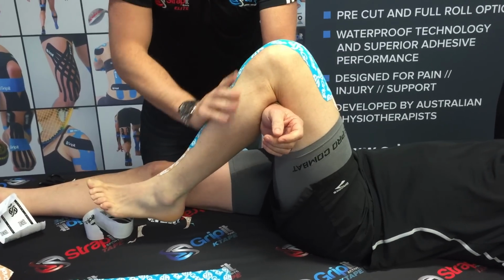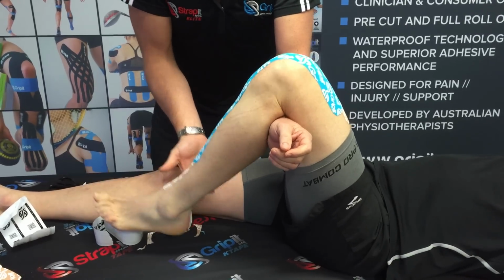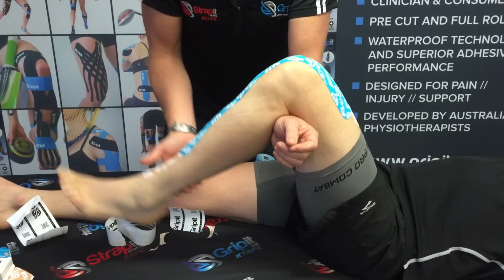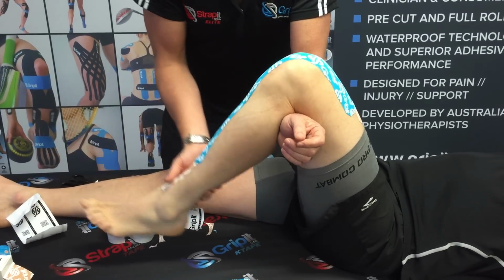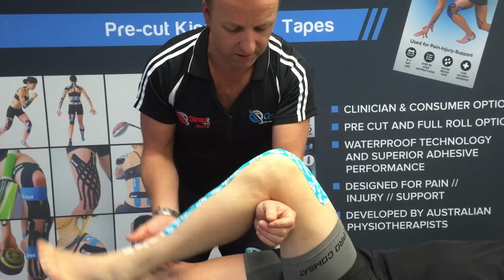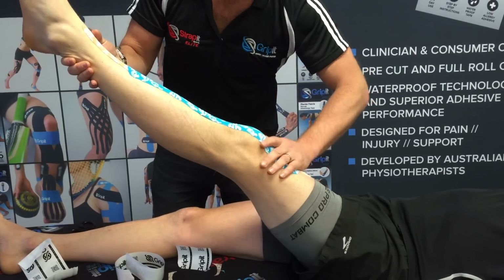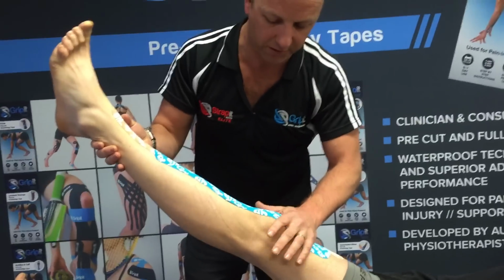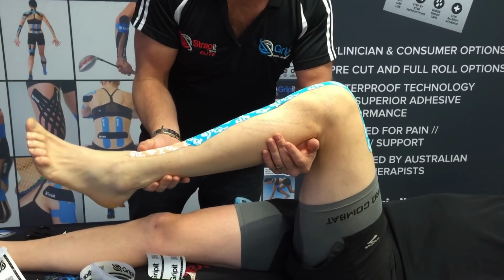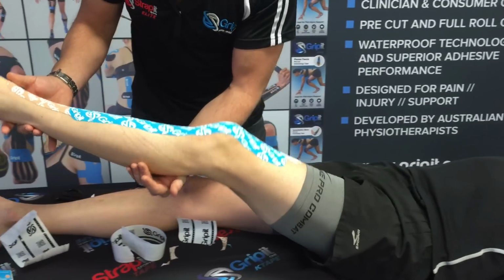So you can see this massive tension and energy that goes through the tape, and it almost acts like a bungee. If I try and look at that sort of flexion to extension moment of the knee, I can actually feel that that is really easy to do because the tape is assisting with trying to encourage the knee back into extension. And that's the mechanical advantage of this tape, that it actually allows extensibility and tension, because I've already put that on stretch, so it's already now providing a little bit of tension. And as I flex, that load and that potential energy into the tape is not taken into the knee, and then it has a potential to bungee back out again.